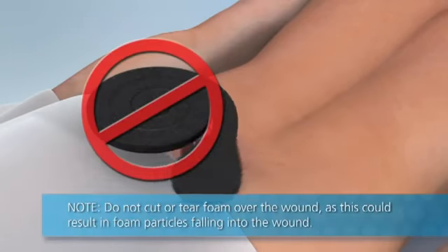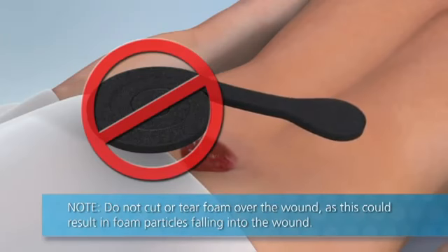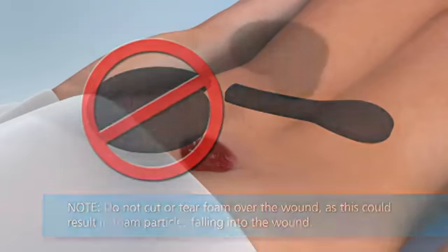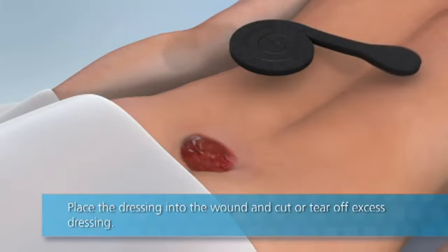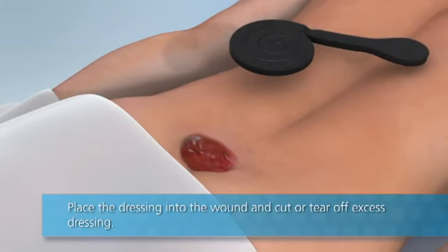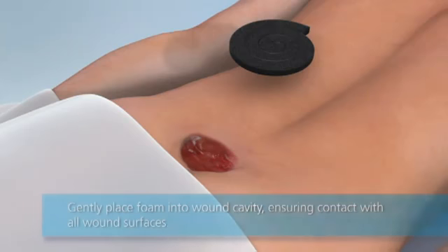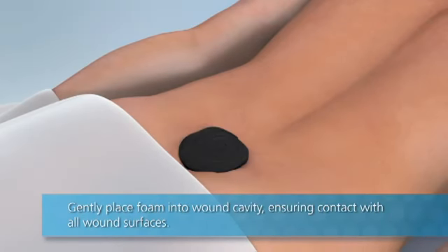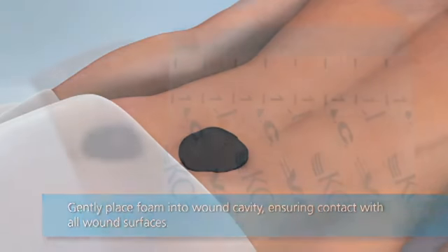Note: do not cut or tear foam over the wound, as this could result in foam particles falling into the wound. Place the dressing into the wound and cut or tear off excess dressing. Gently place foam into wound cavity, ensuring contact with all wound surfaces.